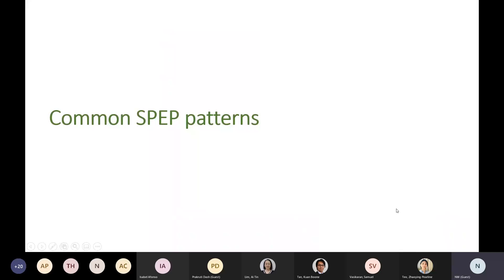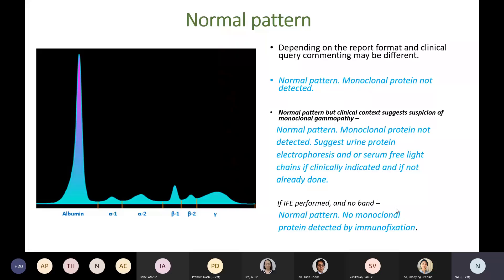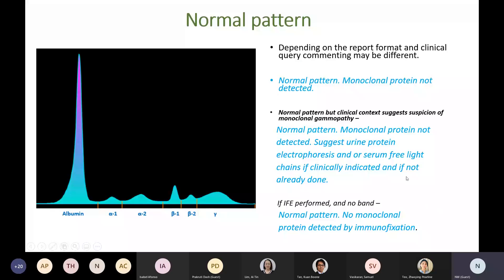We will go through a few common patterns and possible interpretative comments. Depending on your report format and clinical query, commenting may differ for a normal pattern. It is useful to comment on the absence of monoclonal protein and whether immunofixation was performed. For example, you can comment: 'Normal pattern, no monoclonal protein detected by immunofixation.' You could also suggest further testing such as urine protein electrophoresis and serum free light chains if clinically indicated and not already done.